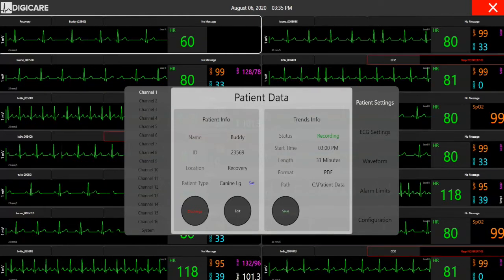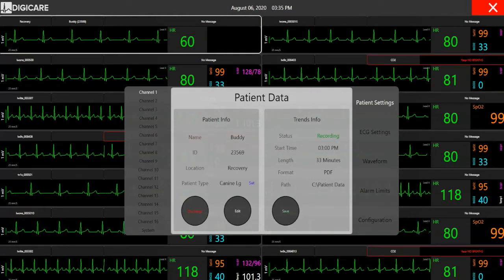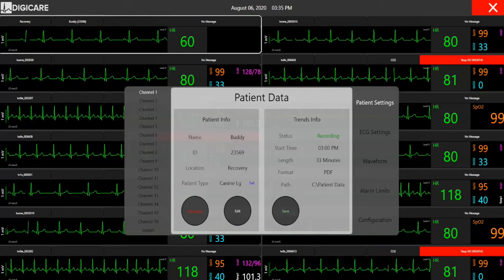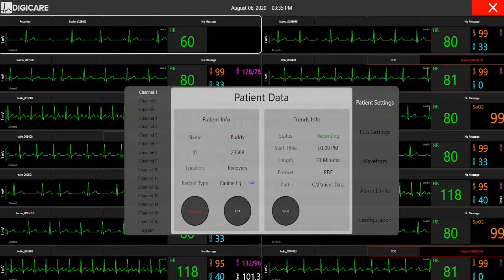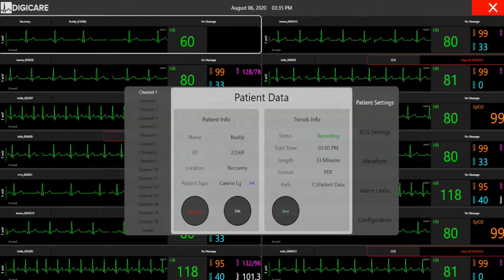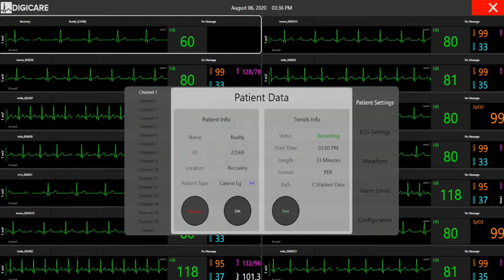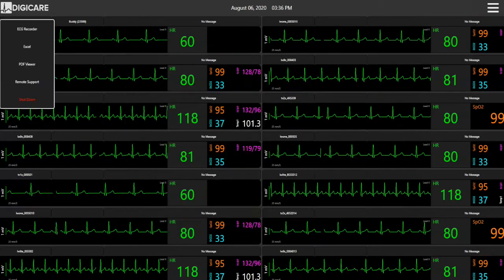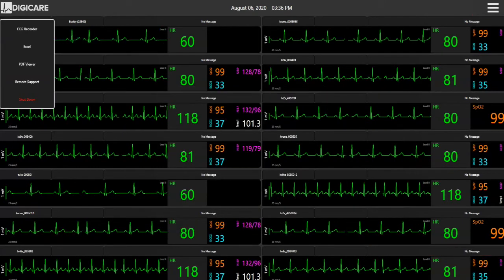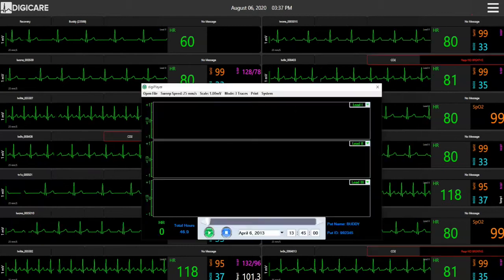Once the patient has been discharged, the CentralView automatically saves the full ECG recording and the tabular report. You can easily access all ECG records and vital sign reports in the system menu.